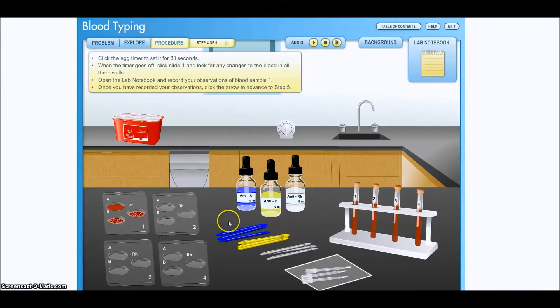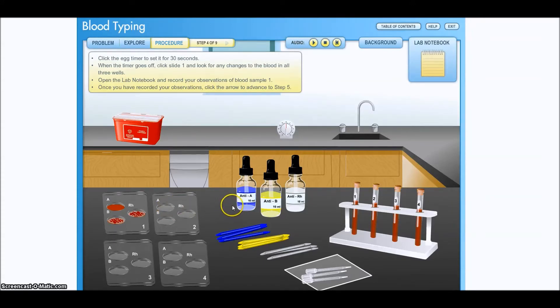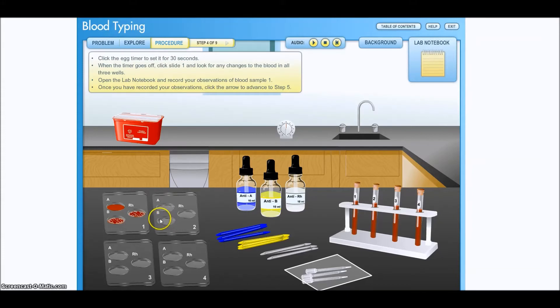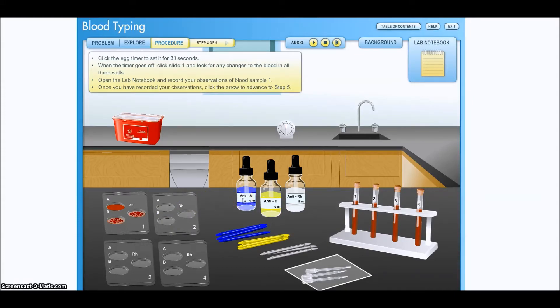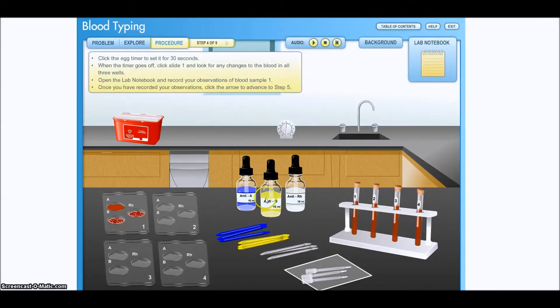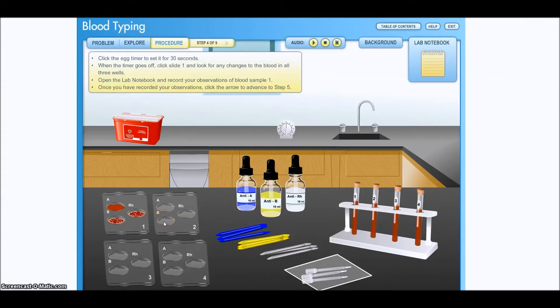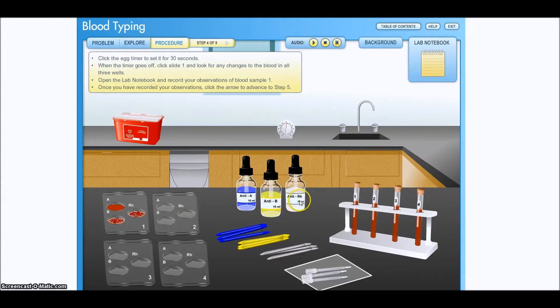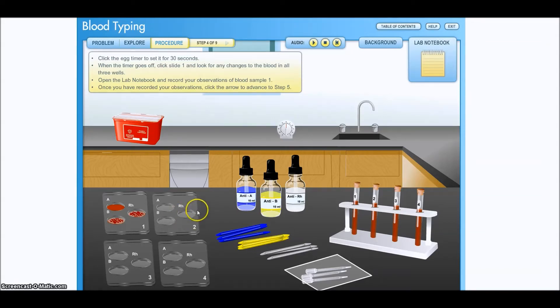So, as I was saying, my blood is O positive, which means I do not have A antigens on my red cells. I do not have B antigens on my red cells, but I have RH antigens on my red cells. So when I put the antibody for A into my blood here, I won't get any clumping. And when I put the antibody for B, which is the anti-serum, has the antibody, into this B well with my blood in it, I will not get clumping. But when I put anti-RH into this, I will get clumping, because this antigen is going to cause these red cells, which have the RH protein on them, to bind together. And we'll get clumping here.